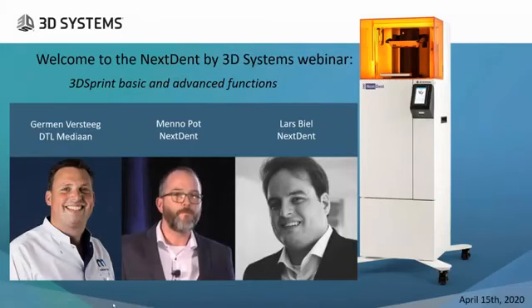What makes today's webinar extra special is our guest presenter, Germen Versteeg. Germen is the founder and owner of DTL Mediaan in Heerhugowaard, the Netherlands. In his dental lab and clinic, they follow a digital integrated workflow for all kinds of dentures, crowns, bridges, and implant restorations by using an intraoral scanner, as well as CBCT, lab scanners, 3D printers, and milling machines.